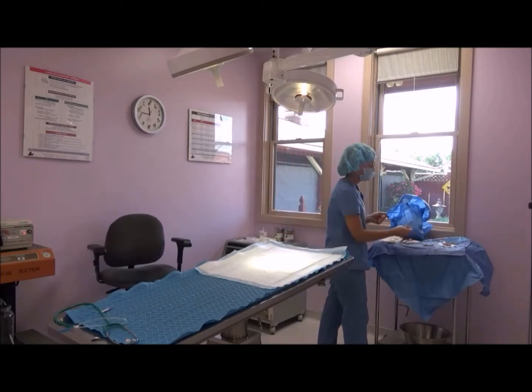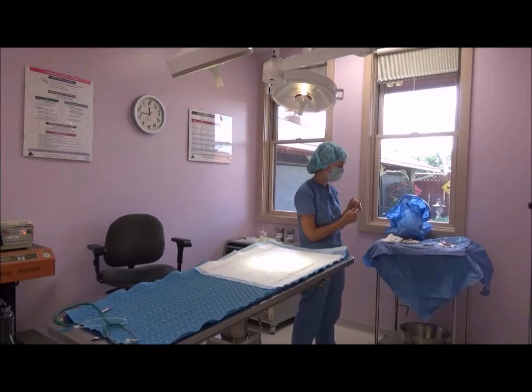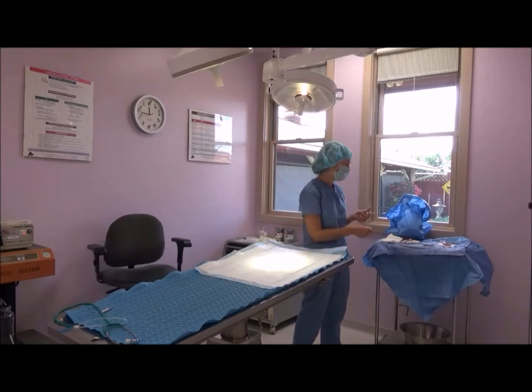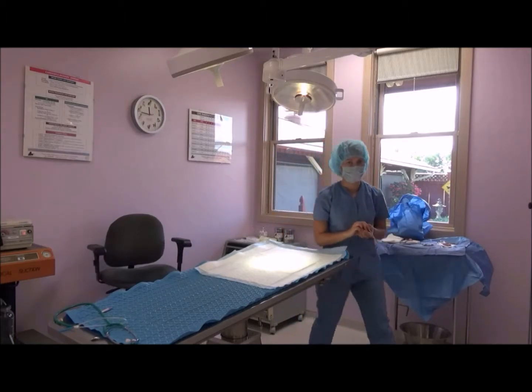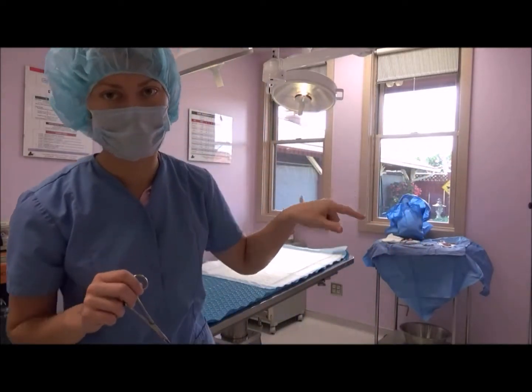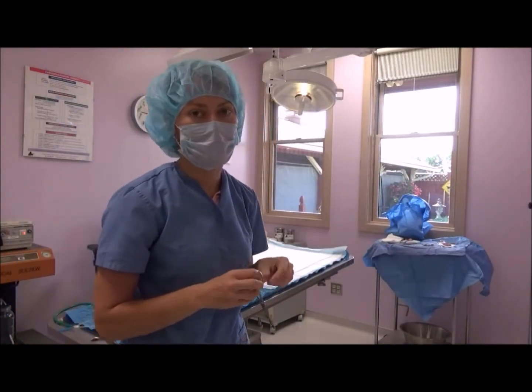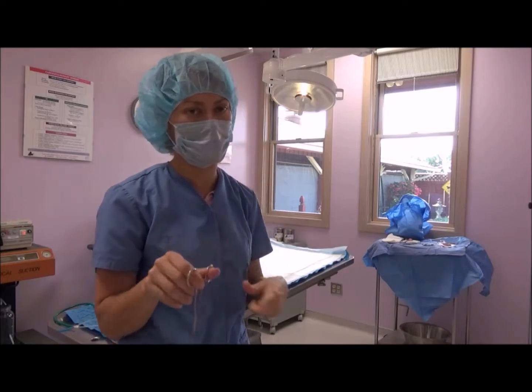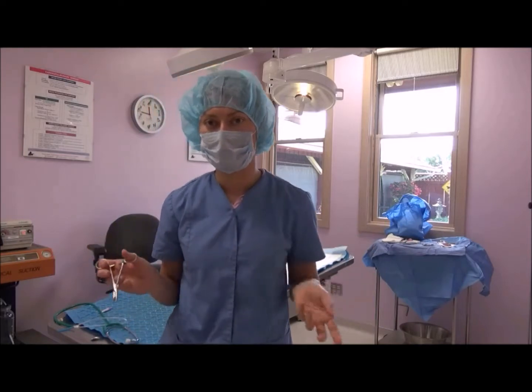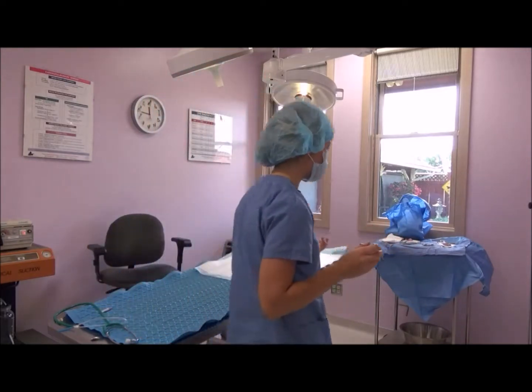But if I needed to take the blade off the scalpel handle, I would use the needle holders only. It's the only tool designed to hold metal. I would take that off, and then I would carefully walk and dispose of it into our sharps container we have just outside of the surgery room. Same thing with the suture needles. Be very careful handling them, and then dispose of them in our sharps container. The sutures we use here primarily are all disposable.